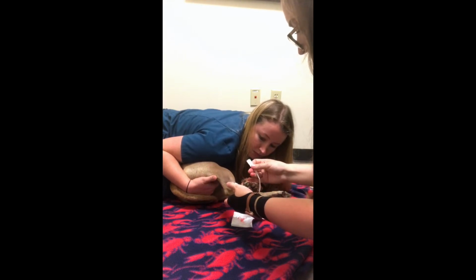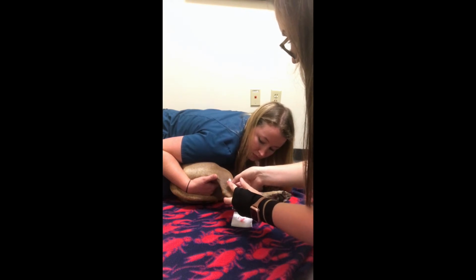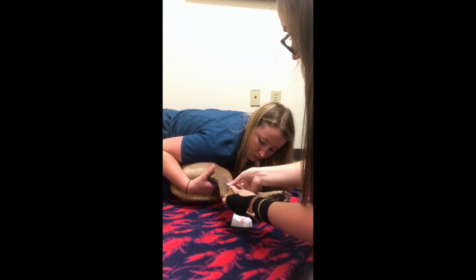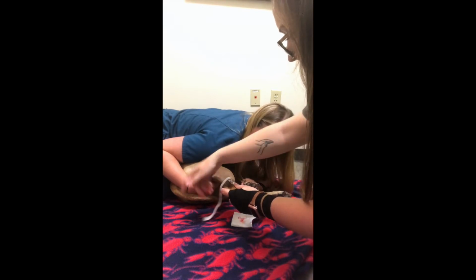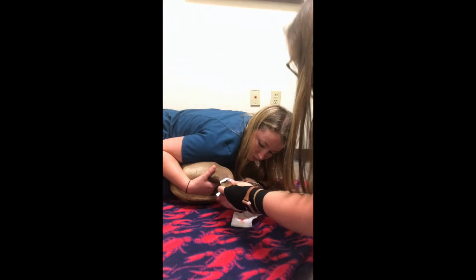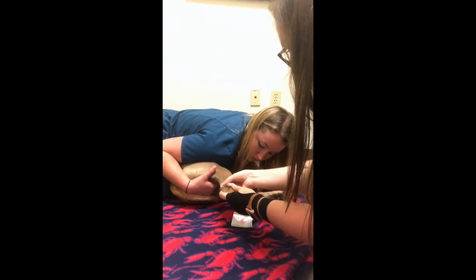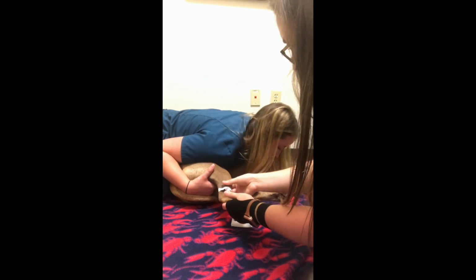Tape job is going to be different from technician to technician. You always want to have tabs on your tape, and you don't want to make the tape too tight to where it's cutting off circulation, but you want it tight enough to where it doesn't slide.